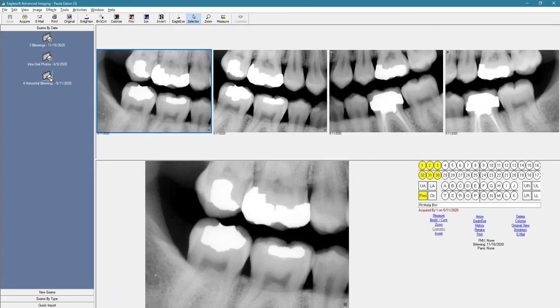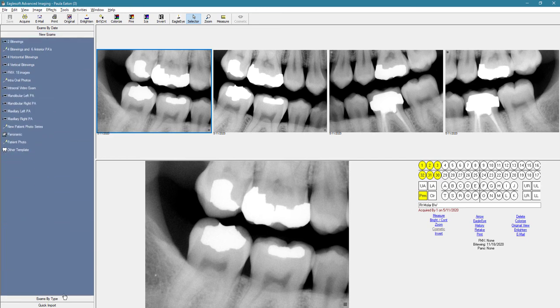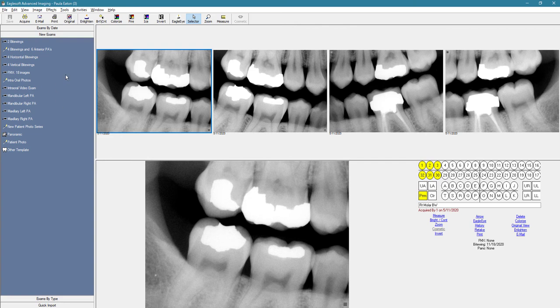And if you want to take new x-rays, we're going to go down to the bottom and then click new exams, and then we're going to choose one of the templates listed. So let's say we want to take an FMX. We're going to left mouse click on the FMX template.